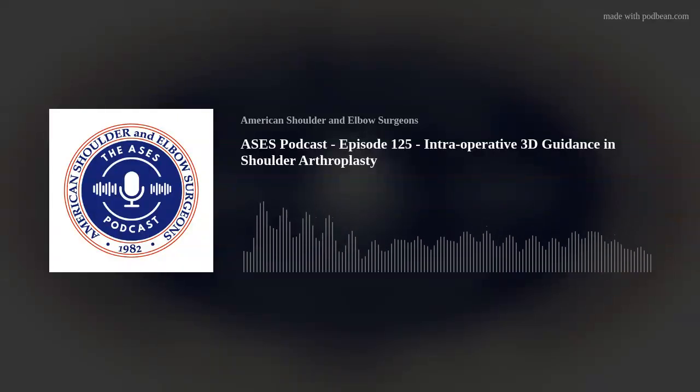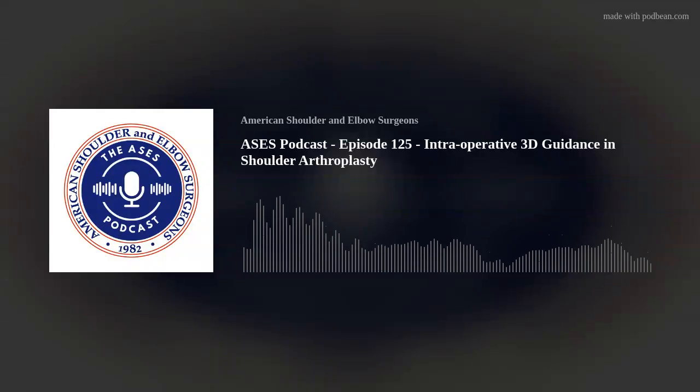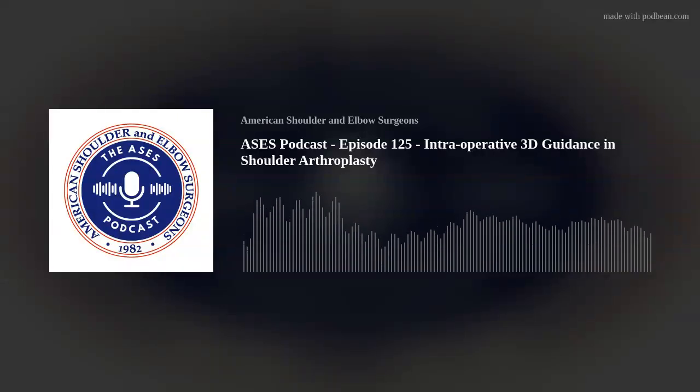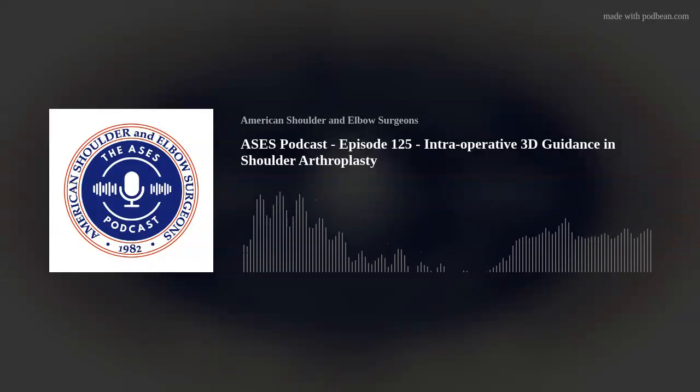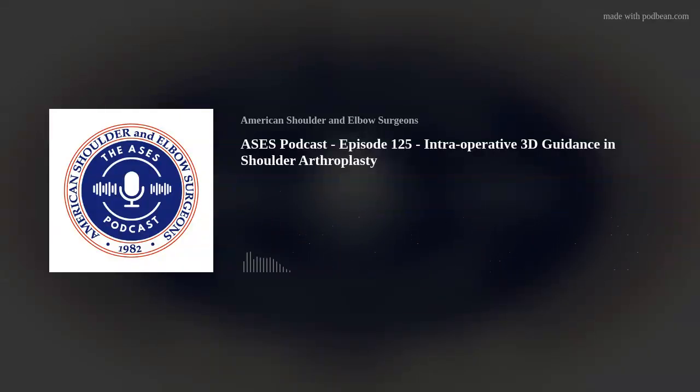And the most important thing is the soft tissue balance. I take your point, Thomas, about getting the cuts right and getting the balance right. But really, the shoulder is a far different animal to the hip and knee, where the soft tissue balance is so crucial, as we know, and even when we're doing reverses for intact rotator cuff. And I think that's an area where the basic sciences need to take us to the next level and incorporate that into the planning and execution, because right now we have no idea about soft tissue balance when we execute. Doesn't matter which way we do it. So that's an important area that we all need to do some more research on.